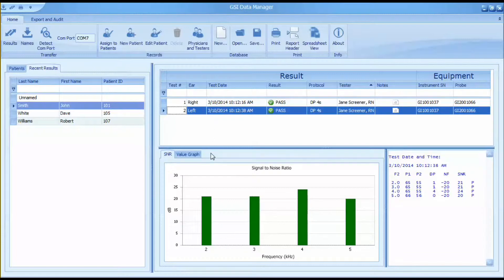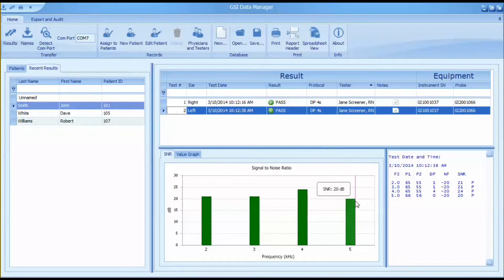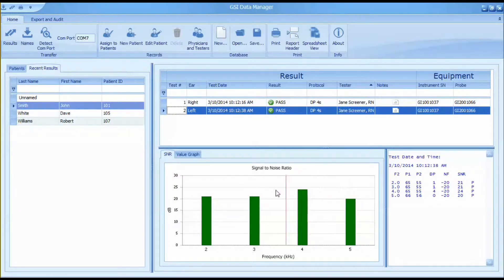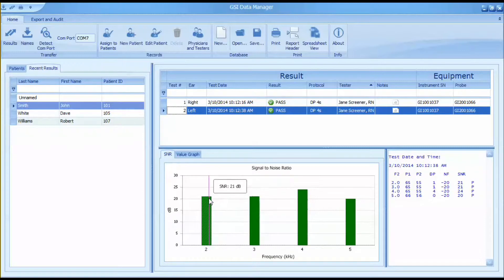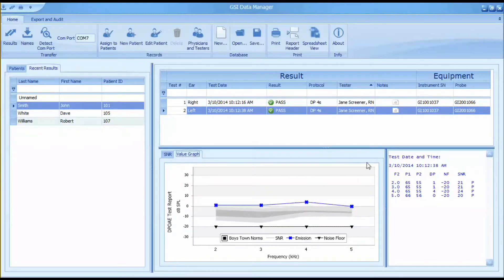Below the result window, the individual test information can be viewed in three ways. The signal-to-noise ratio tab displays a bar graph of the signal-to-noise ratio at each frequency tested. For screening protocols, the bars are green to indicate a pass at that frequency.